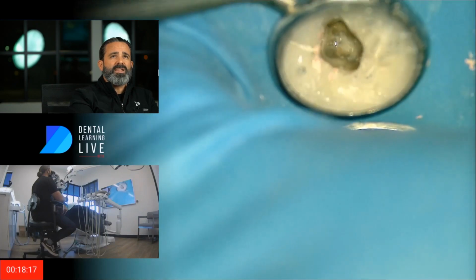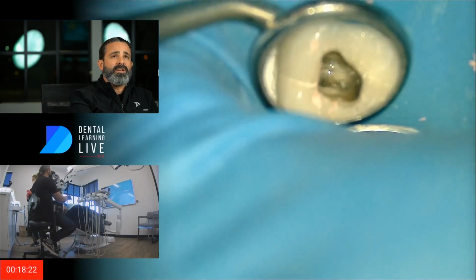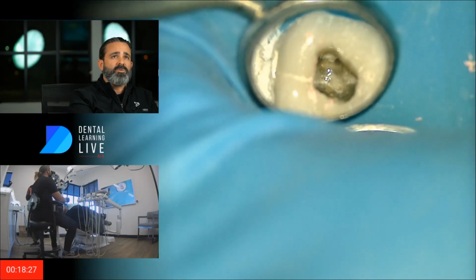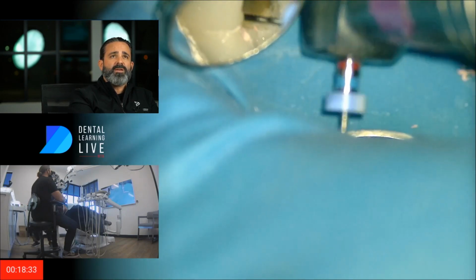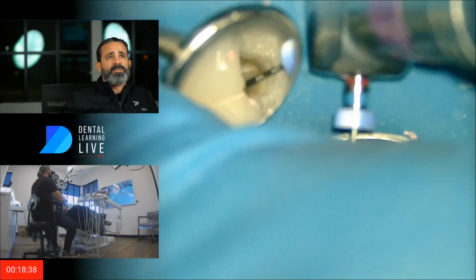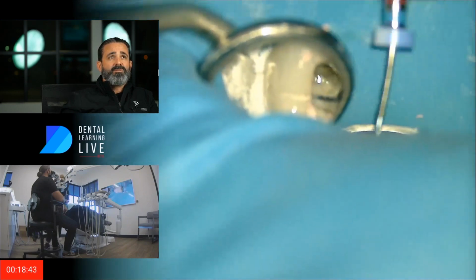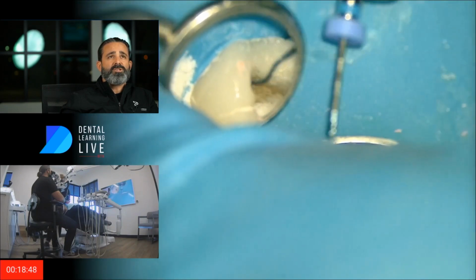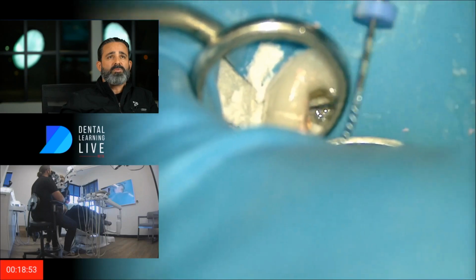And right there, I was getting a hint of whether there was a DB2 or an isthmus connecting back to the palatal. So I was poking at maybe a stone in some sort of isthmus between the distal buccal and the palatal. What I chose to use to pick up any other fragments of gutta percha in there was this 3D Shaper by Brasseler, and I really like that. It's really wobbly, looks like a hula hoop going on in there. And that's what I'm using to see if I can engage any of that gutta percha up on the walls, which you can see I'm dancing with right now.